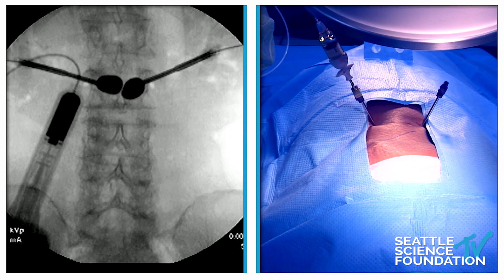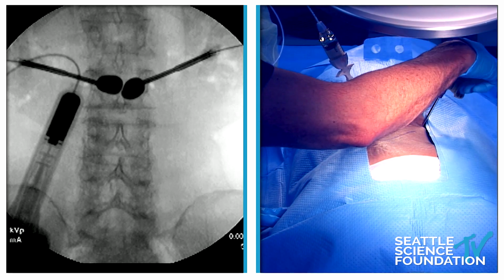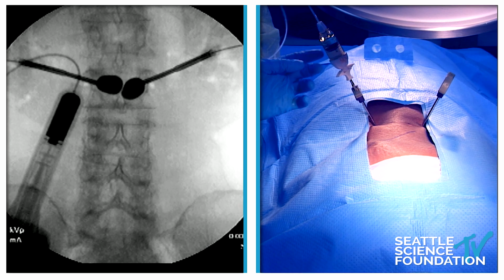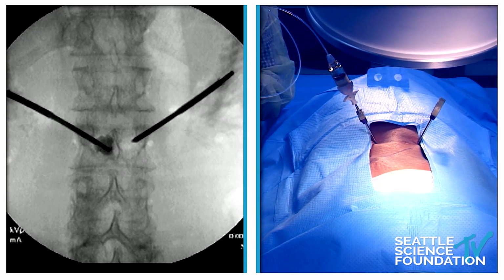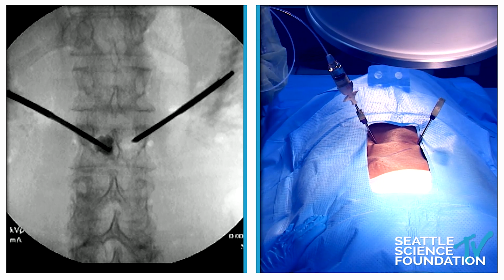So I'm going to put the stylet in the other needle, and we will inject. And so this is out of the field injection. Go ahead and trigger that. And this is water in here that will pull up. And we can see the cement being injected in the vertebral body. Now we'll flip to lateral and monitor the injection on the lateral.